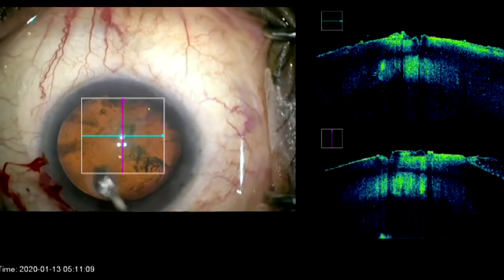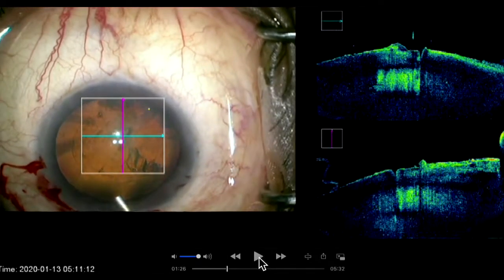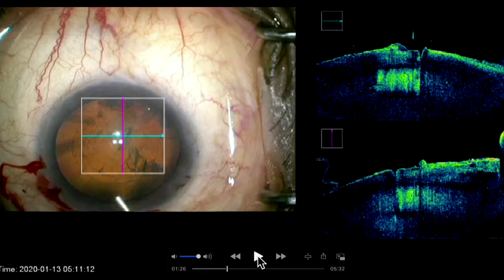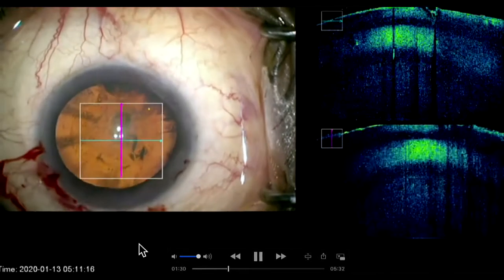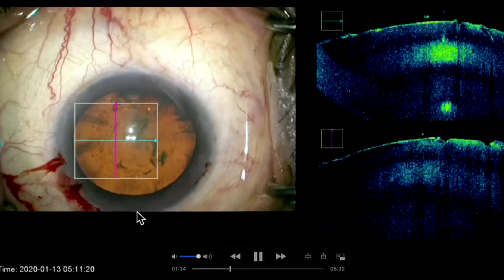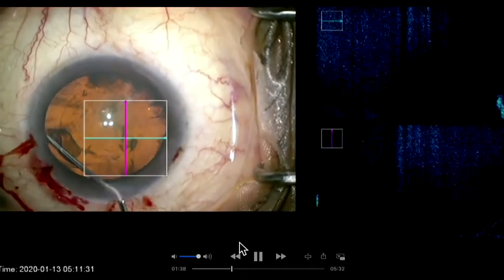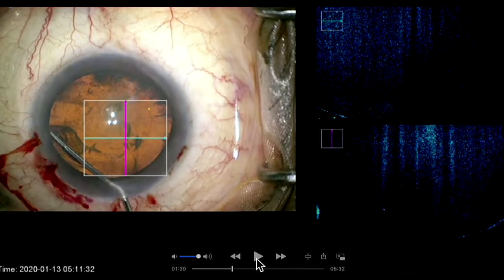Subsequent to the capsulorrhexis, we initiate the hydro procedure. Before you begin, first you must remove the viscoelastic from the anterior chamber so it doesn't pressurize the chamber. Second, do the hydro procedure from the main tunnel — never from the side ports, because you can increase pressure and in a weak capsule that can cause a problem. I have taken all the viscoelastic out by pressurizing the limbal area. Then I will go with fluid injection, first going just behind the anterior capsular edge without injecting, then inject the fluid. You should use a 1 cc or 2 cc syringe so that the pressure is low and the fluid doesn't go in too rapidly — this is especially important for cases with posterior capsular weakness.